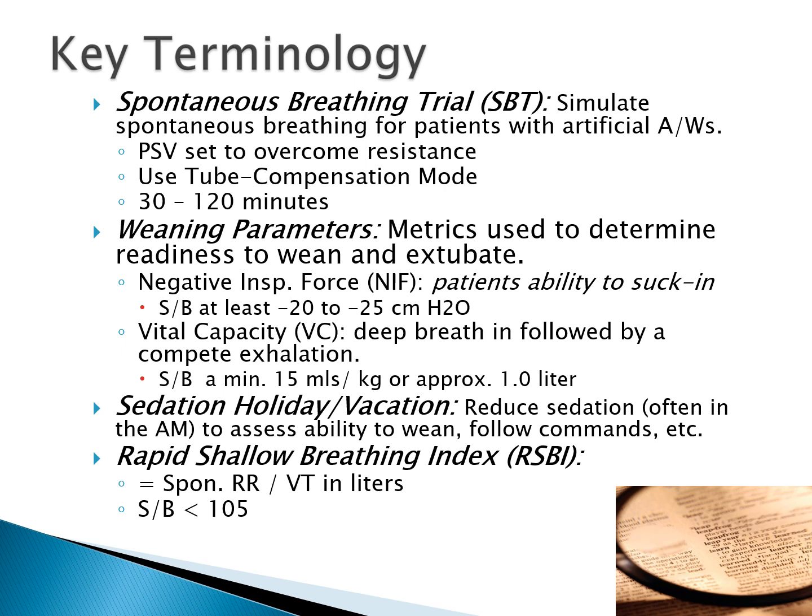Many ventilators have tube compensation or equivalent modes. The Covidien Puritan Bennett 980 has TC, or tube compensation, where you put in various parameters, including the tube size and the amount that you want to compensate for, and it will emulate a spontaneous breathing trial. There are others as well. You can put a patient on a T-piece. The problem with that, which was sort of the standard of care, or at least the recommendation for a number of years, is that it's actually more difficult for patients to breathe with an artificial airway than through an anatomical airway. The reason for that is it's smaller.